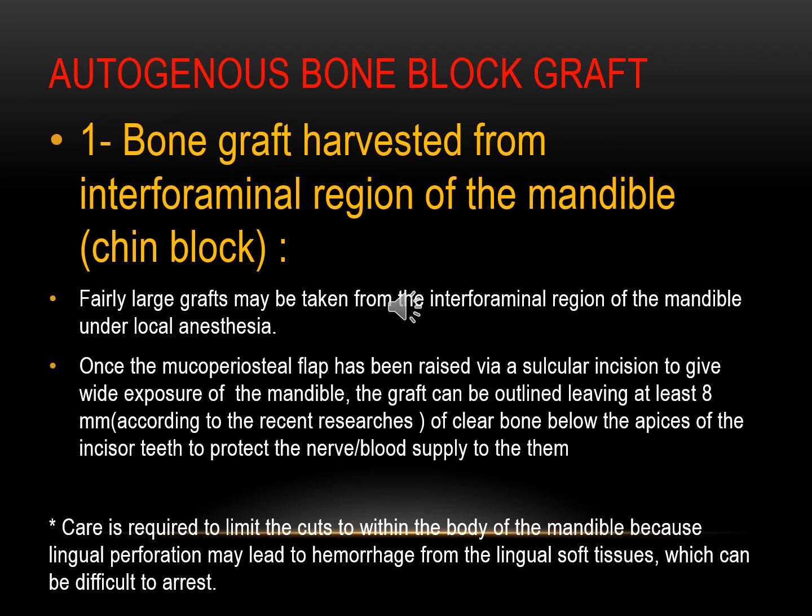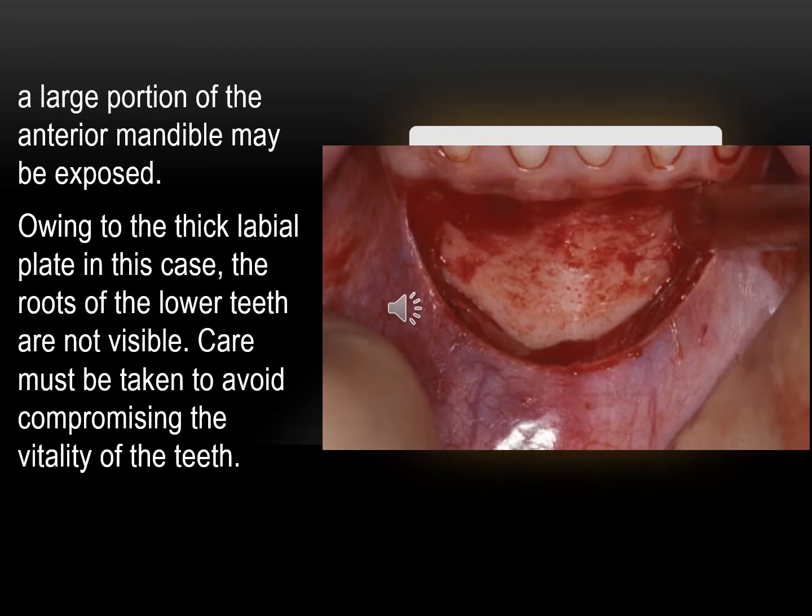Here you can see the flap for harvesting of the chin bone graft. Large exposure of the chin bone in the buccal area of the mandible.